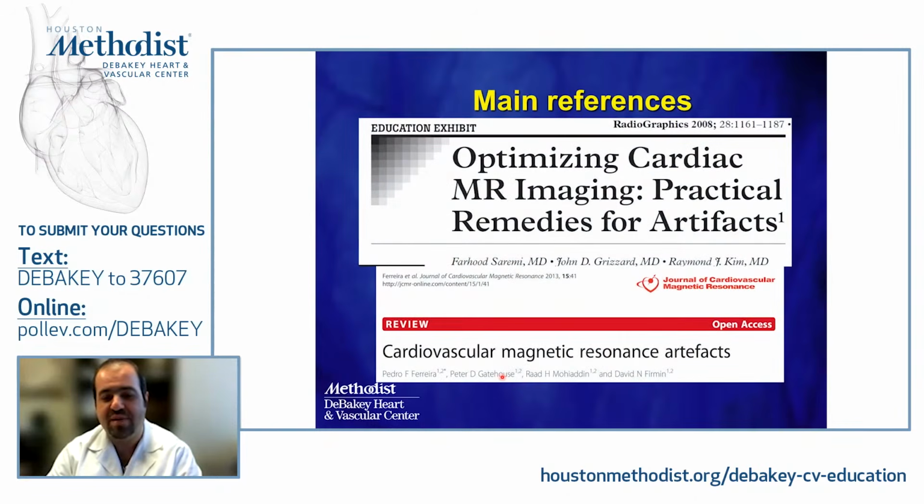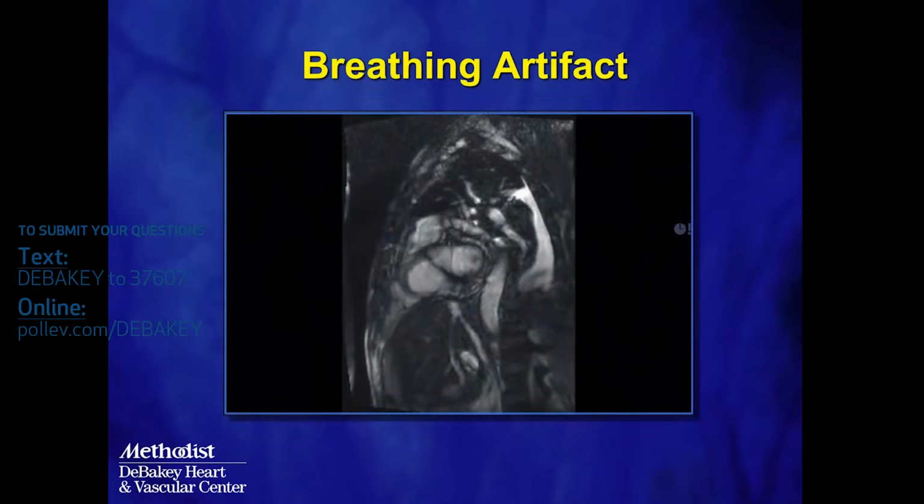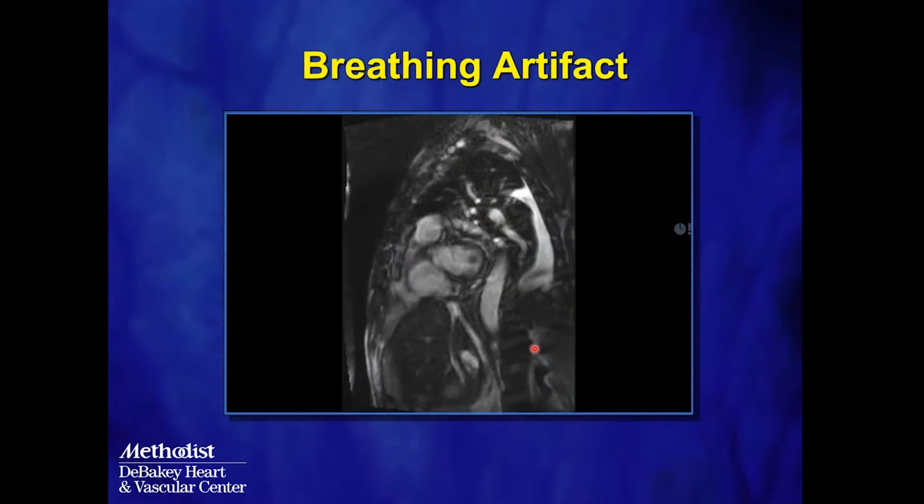These are one of the two best resources for MRI imaging artifacts. I would like to make you aware of these resources because they're great teaching files in order to learn more about the tips and tricks of those artifacts, how to recognize, and also how to eliminate.